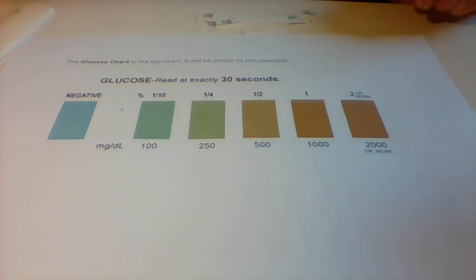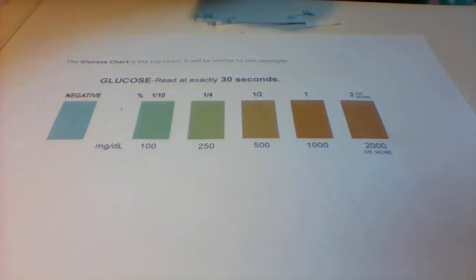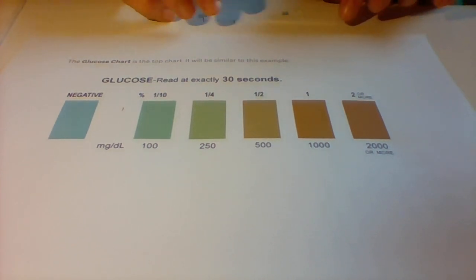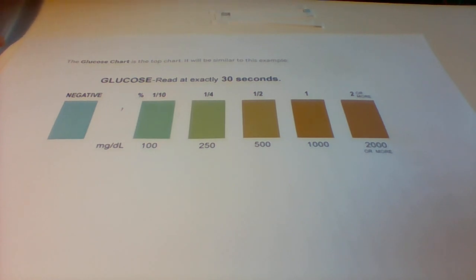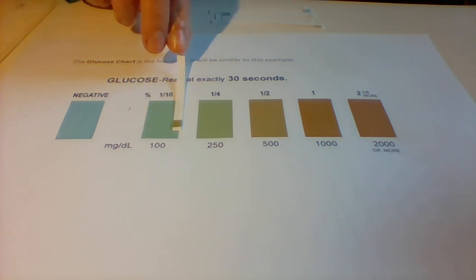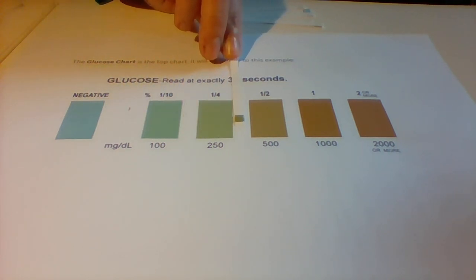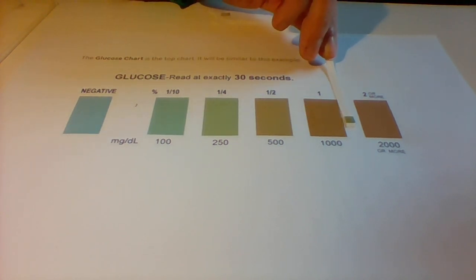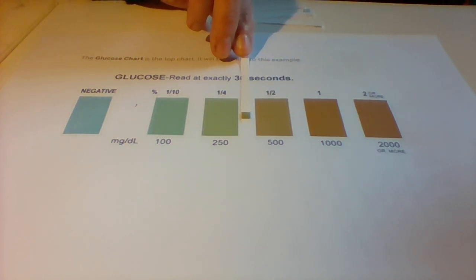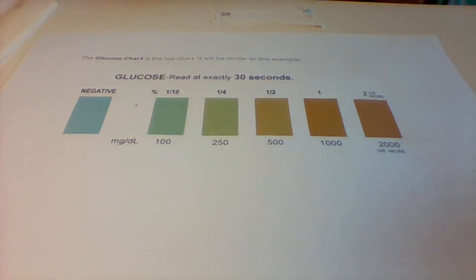Now we are going to test patient B. Got my samples, turn them around. Right, now we're back. We are now measuring the blood plasma of patient B. So the first measurement of patient B is taken at 6:30 a.m. And here it is. So this is patient B, 6:30. Where do you think that matches up? All right.